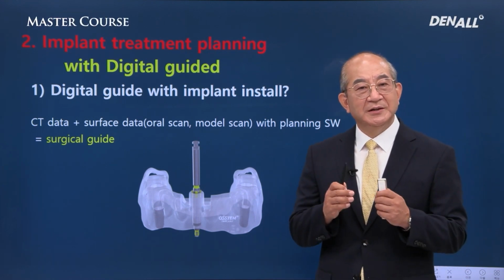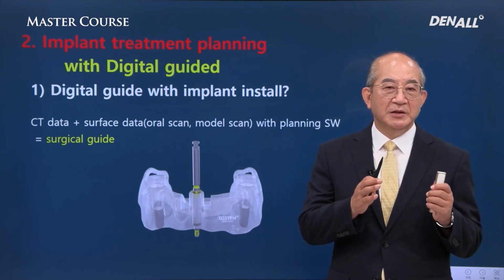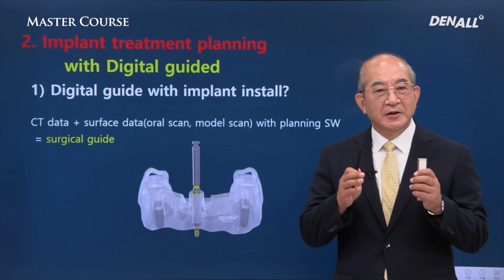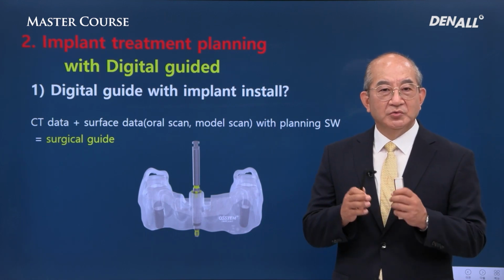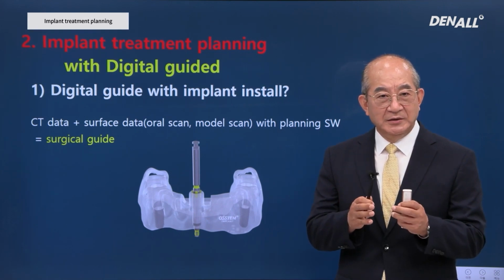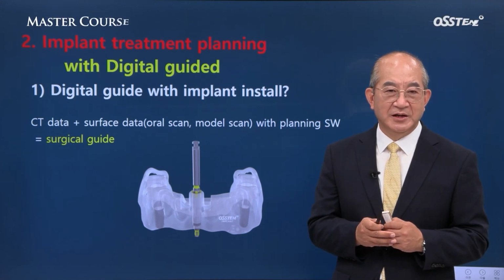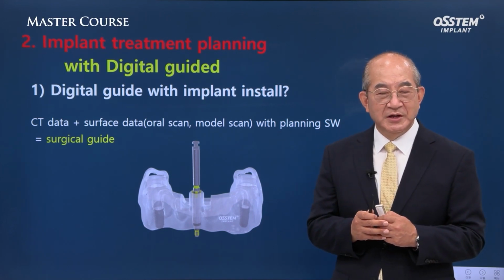Digital dentistry-driven implant placement is based on treatment planning using these digital techniques. The most basic is CBCT data and surface data of oral cavity. Mixture of these digital data leads to surgical guides, and it will be digitally driven treatment planning.